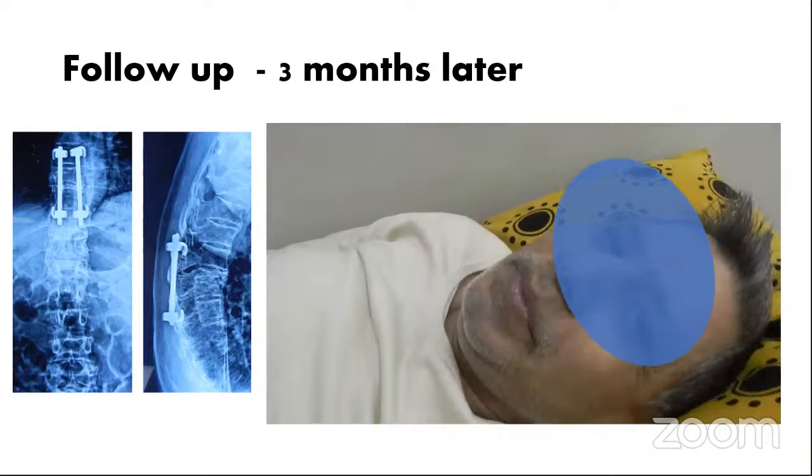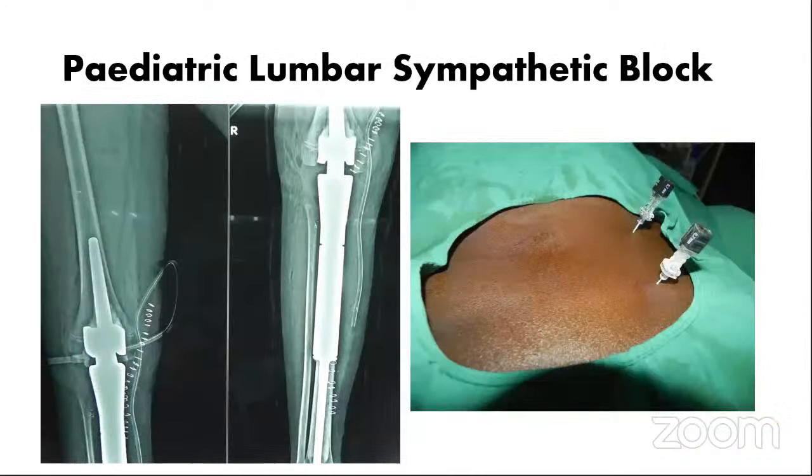So this patient had good relief, 70% pain relief, after a continuous sympathetic block where the catheters were placed and the infusions were initiated, and 5 days after which the catheters were removed.